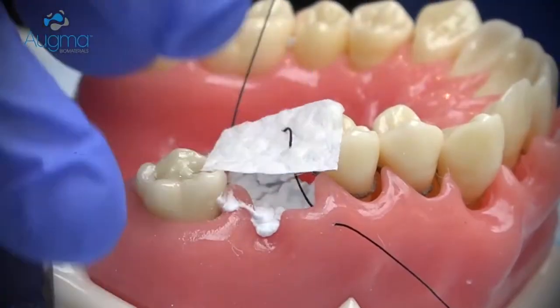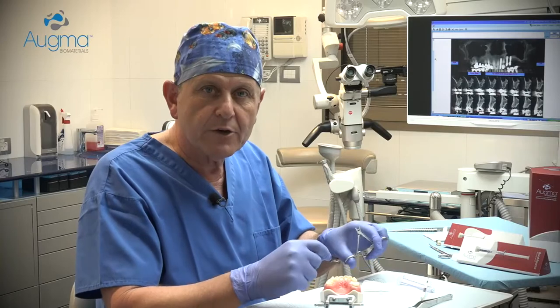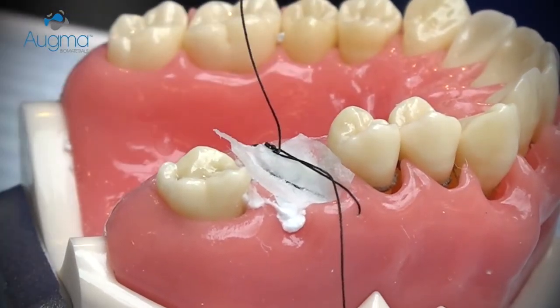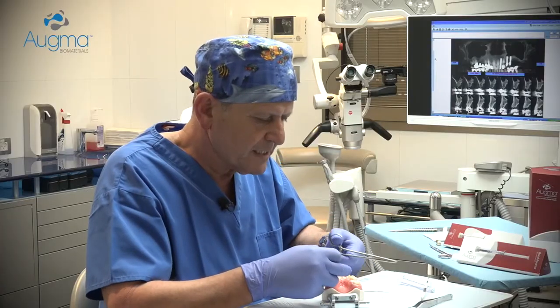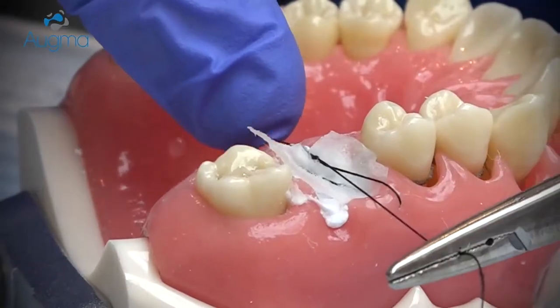Place the sponge above the grafted site and make your first suture to stabilize the collagen sponge in place. Remember that the collagen sponge must be stabilized together with the soft tissue by its first knot.